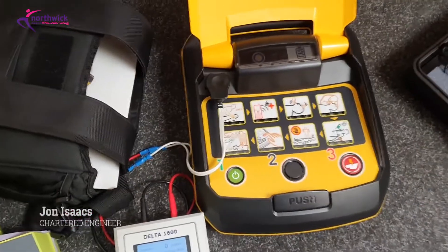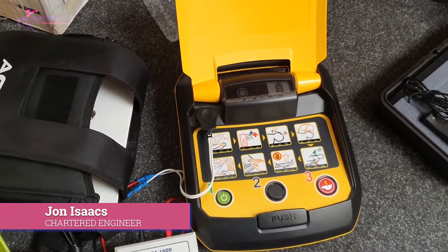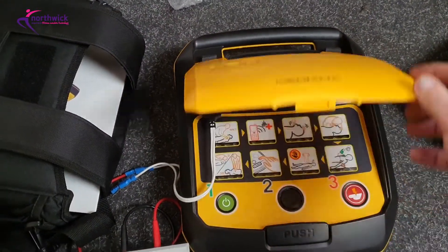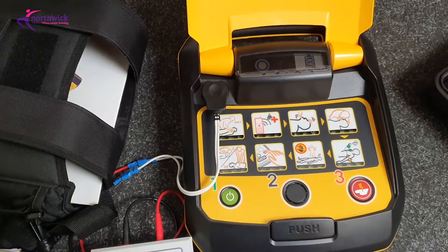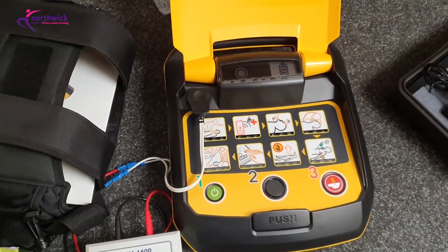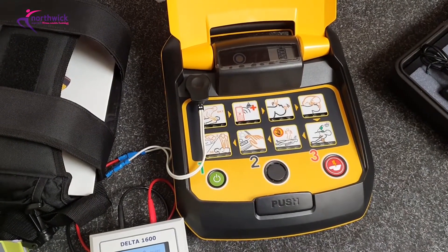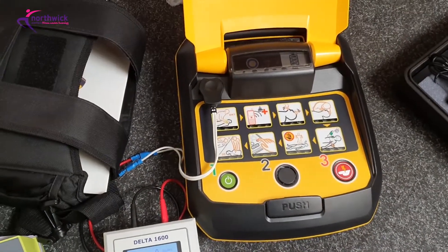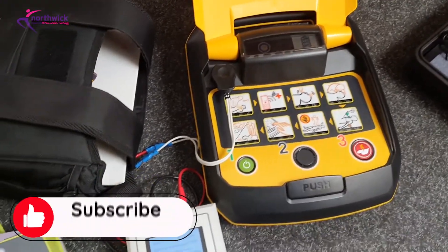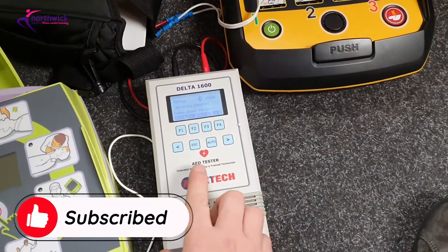Hi folks, this is a quick video to demonstrate the benefit of having your defibrillator tested. This is a Heart On defibrillator with a good battery and it appears to be in good shape. It passes its self-tests, so outwardly there's nothing wrong with it and all indications would suggest it's perfectly fine to work.